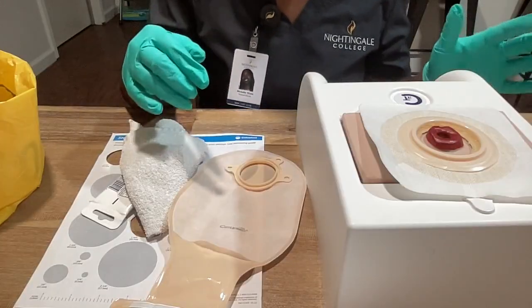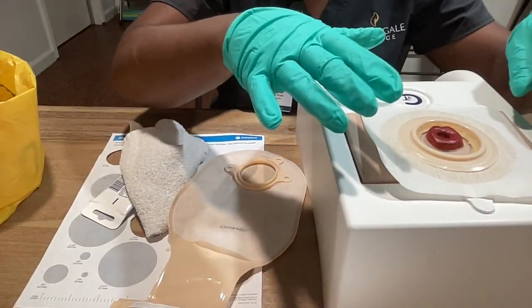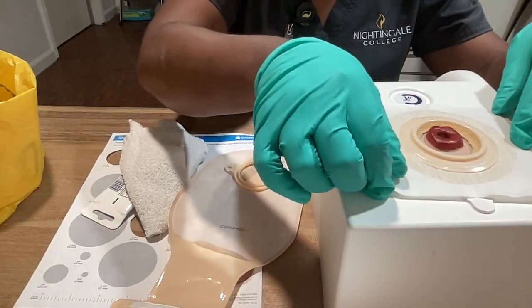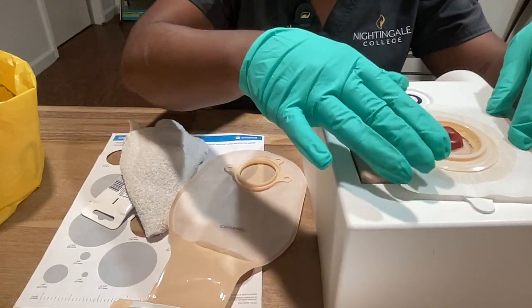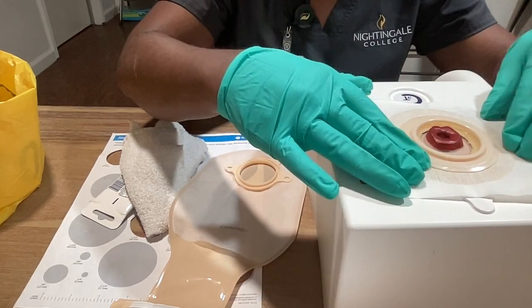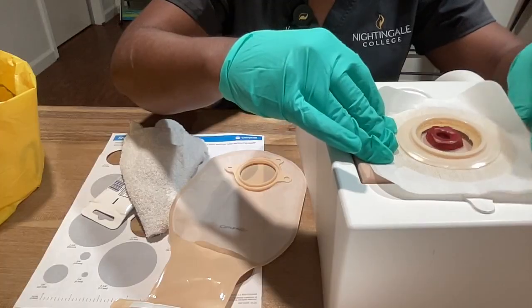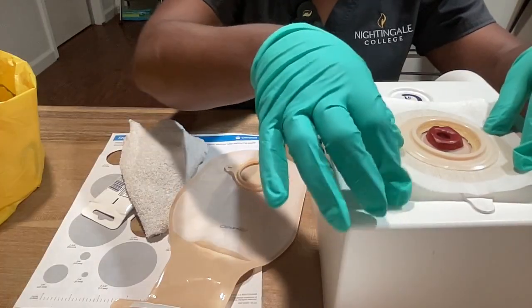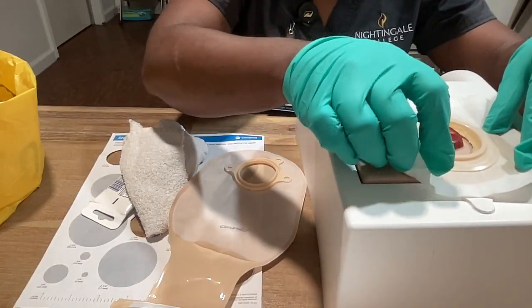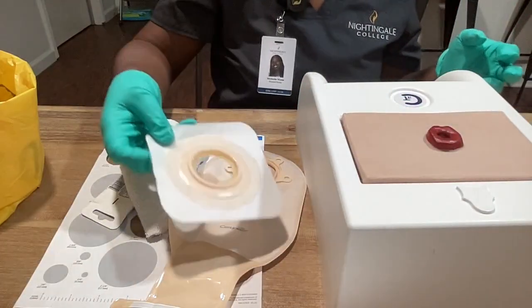Next I will be removing the base plate. Ms. Jones, if you experience any discomfort, please let me know. What I'll be doing next is pulling this off — it's pretty tight, so again if it's painful, please let me know. When removing the base plate, you want to pull the corners up and you want to pull towards the stoma. That will limit the amount of skin tension or tear. And then you would dispose of this.